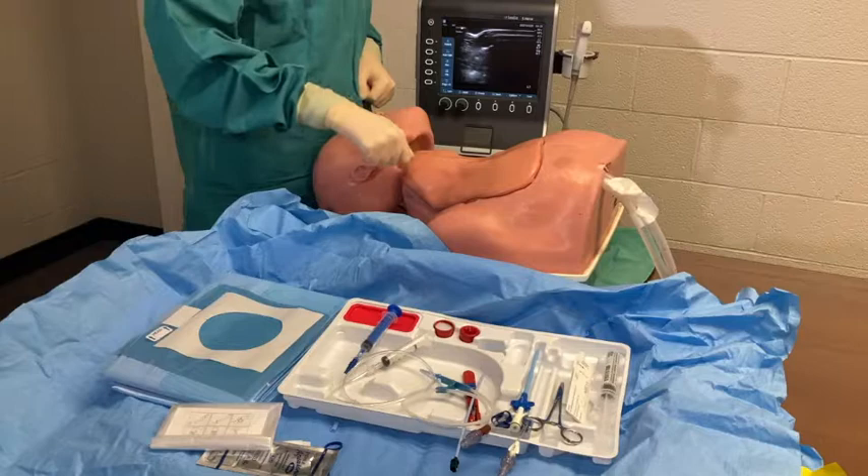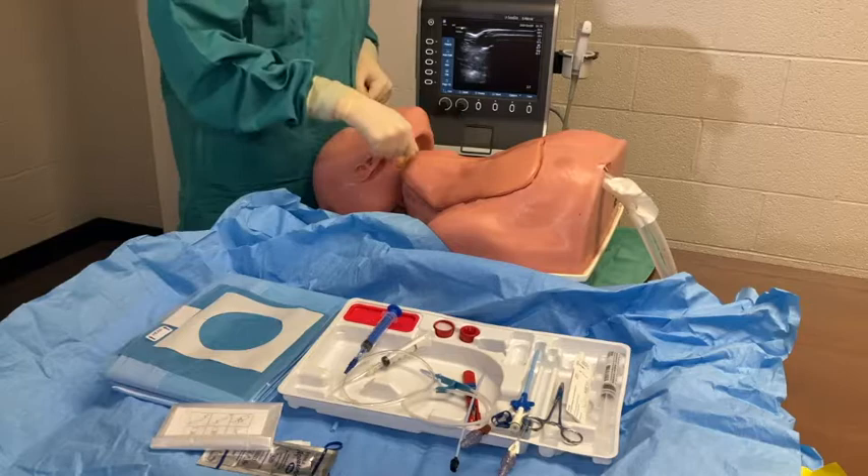The goal of this video is to show the placement of a 9 French MAC introducer. You will start by prepping the patient's right neck with a chloroprep.